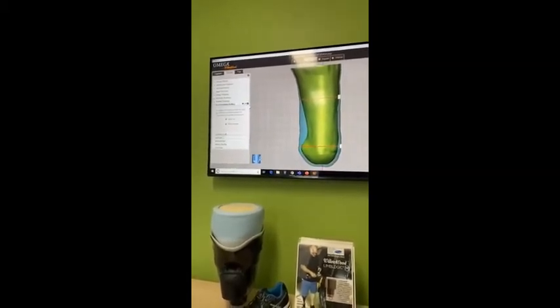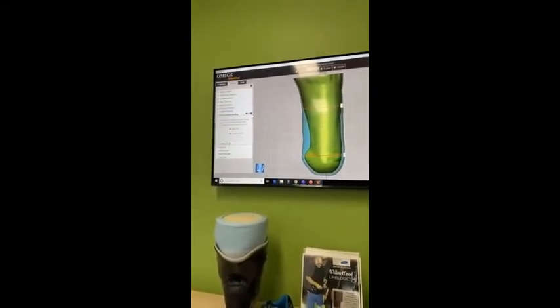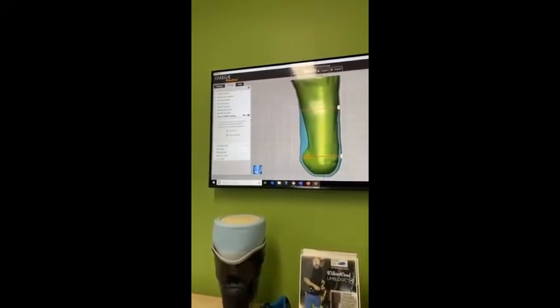Comfort cuff is more for AKs, and it's when you're reflecting the liner over the socket, so it stops all the gel picking up fluff from your material and things like that also.